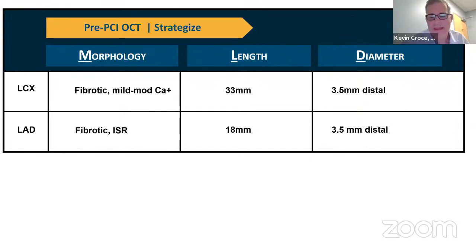Yeah, I thought it would be easier to not fold metal in one direction or the other and have to go through multiple layers, having inherited some layers already. The problem with culotte is that getting the ostia big can be an issue, but I think with double crush culotte, we're getting better at that.